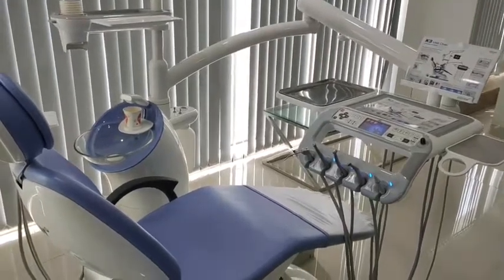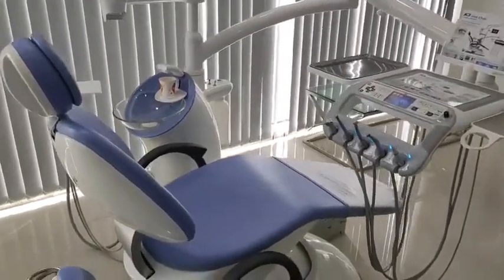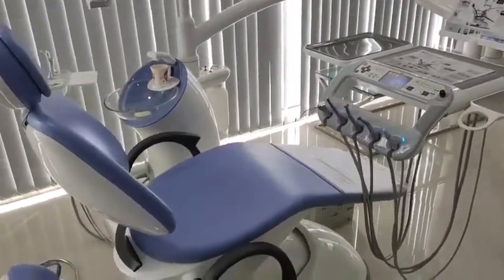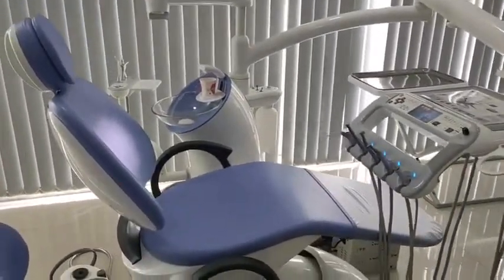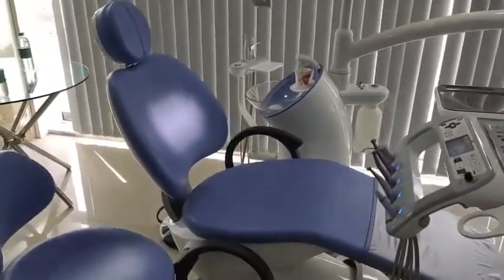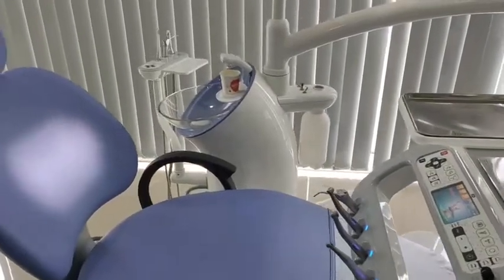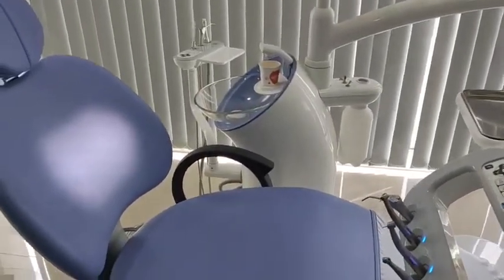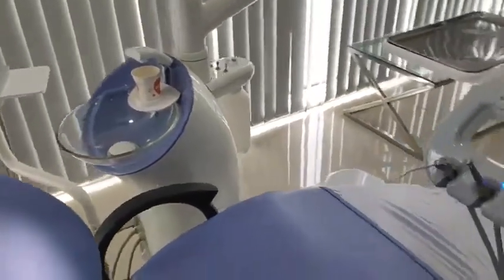Good morning. Today we are going to discuss the K3 unit chair of Austin. If you look at the chair, it has a unique and very viable ergonomic design for the comfort of the patient as well as the ease of doing dental procedures.